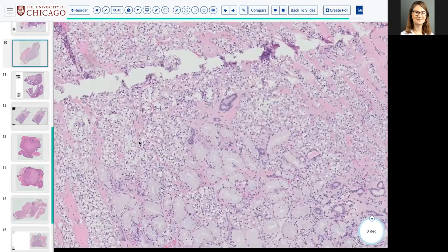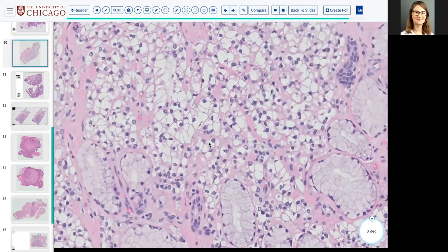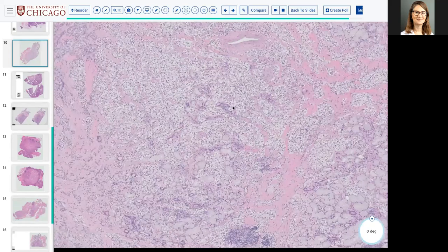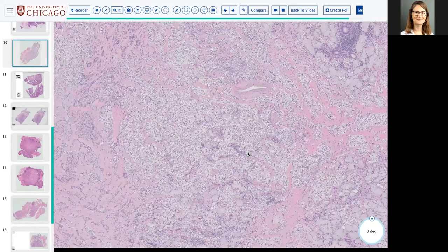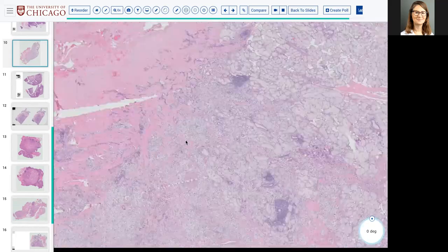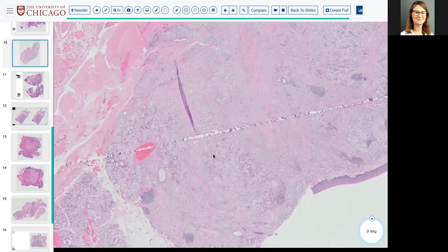So if you have a carcinoma that stains like squamous, but is a little bit lower histologic grade, such as this is not a glycogenated squame, right? This is a clear cell. And yes, it has EWSR1-ATF1 gene rearrangements, which are the same gene rearrangements that you see in clear cell carcinoma within the jaw bones, which is odontogenic clear cell carcinoma. So those two tumors are essentially identical, with the exception of one occurs in the salivary tissue and one occurs in the intraosseous tissues of the head, the jaws. So yeah.